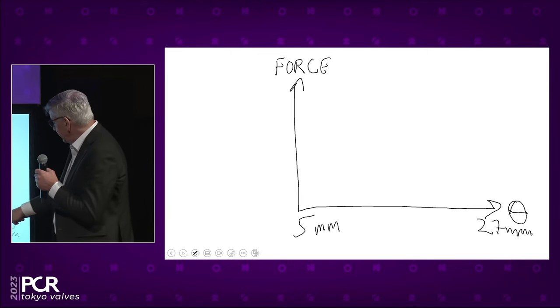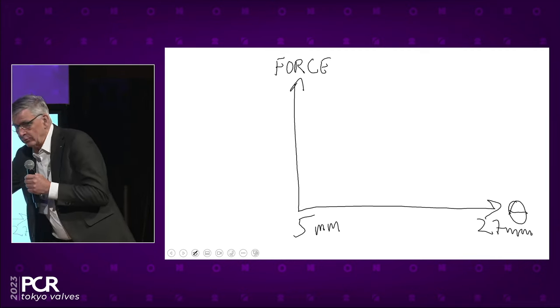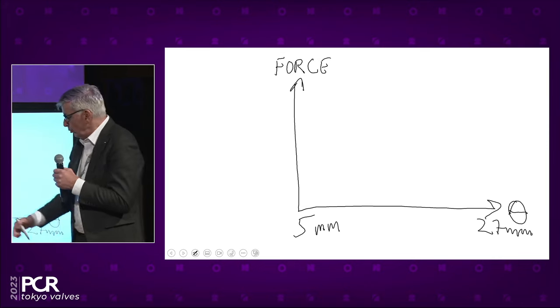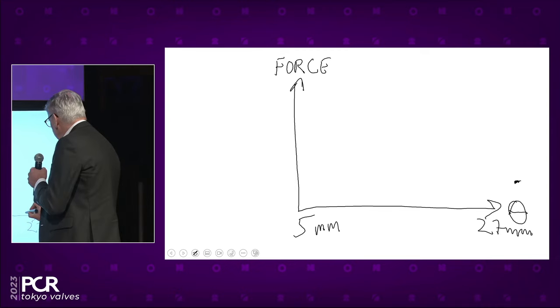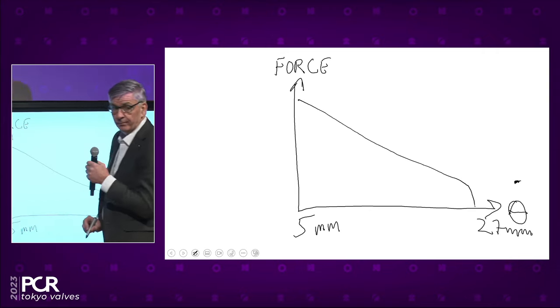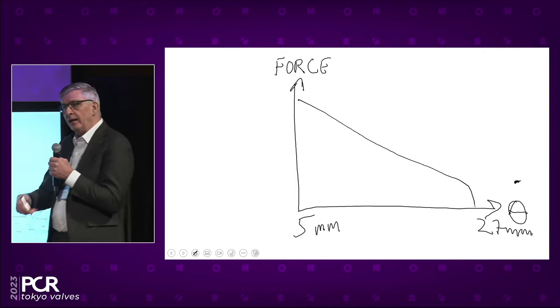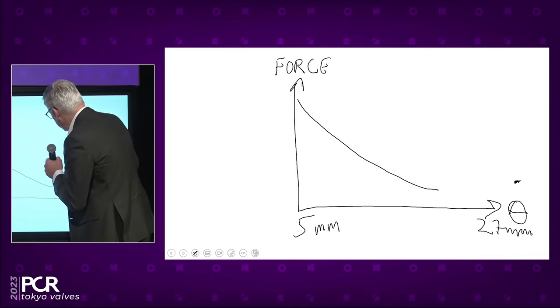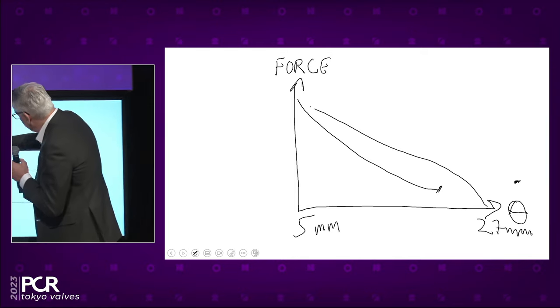So let's say this is the diameter of a valve. Coming down from 27 millimeter, it's crimped down to 5 millimeter within the delivery system. And the force will build up. So what actually happens when you have your valve here on the table before you start to crimp it? It will have zero force. As you start to crimp it, the force is going to build up. It's going to be higher and higher when it's sitting inside the delivery system when you start to deploy it. And then when the valve is coming out, it's going to take a different curve down here until it actually meets the aortic annulus. So let's see if we can do it once again here, up and down.